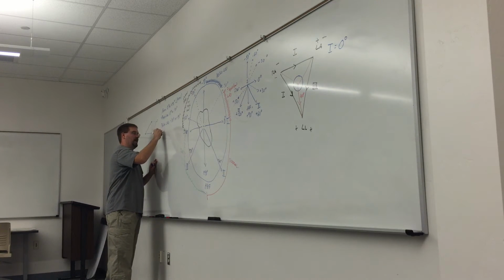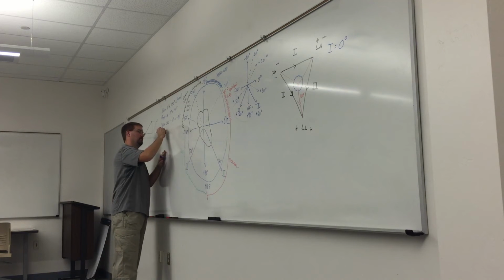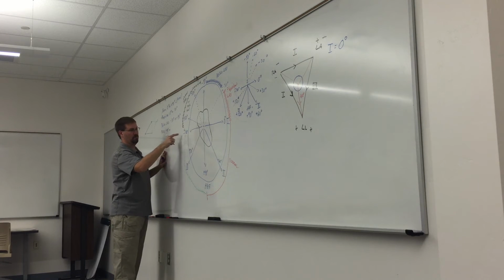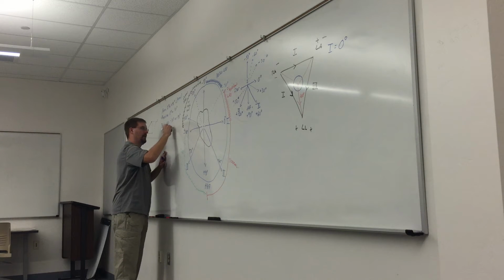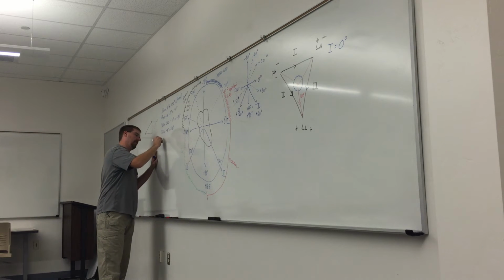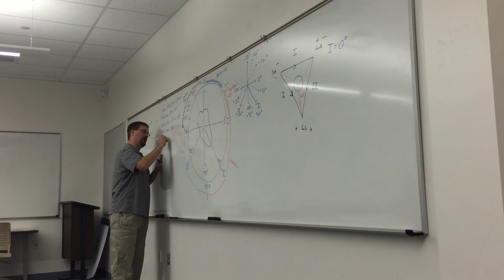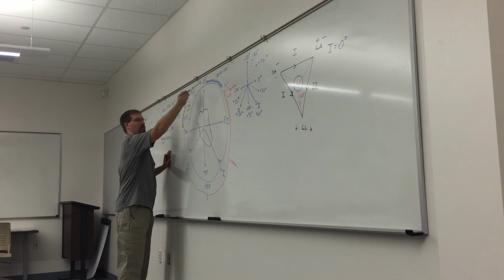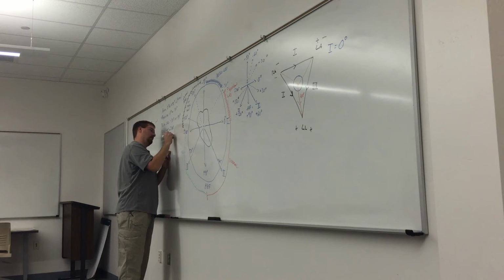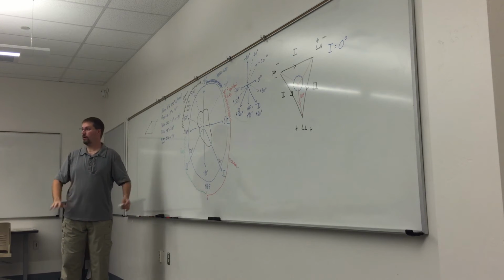Alright, so let's fill in the blanks here. So RAD is going to be from plus 90 to plus or minus 180 degrees. You guys cool with that? And then finally, no man's land, or your extreme right axis, is going to be from minus 180 degrees to negative 90 degrees. All right. Are you guys cool so far?